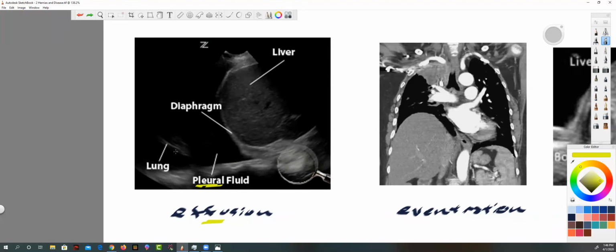You see a little bit of lung. With this amount of fluid, that lung is pretty much collapsed and barely functional. But in any case, like I said, there's nothing wrong with this diaphragm per se. We clearly see the diaphragm going across like that. This patient has eventration of the diaphragm. This liver is way up here, probably pushing the heart a little bit too far to the left. The whole mediastinum, basically this area including the heart, is pushed off to the left on this patient.